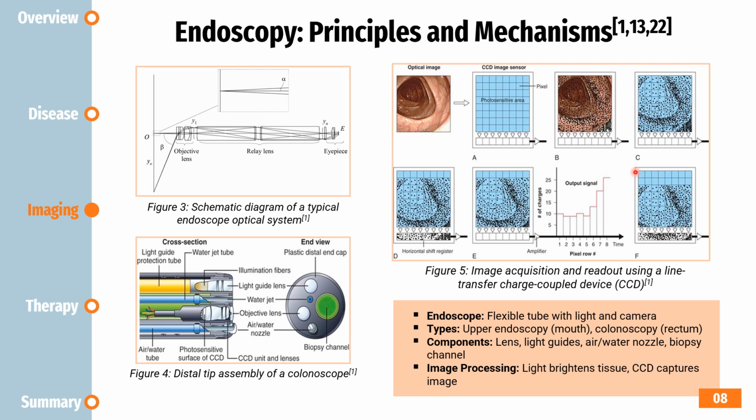The final image is then displayed on a monitor in real time, allowing physicians to examine the internal structures with much higher clarity and precision for diagnostic and treatment purposes.